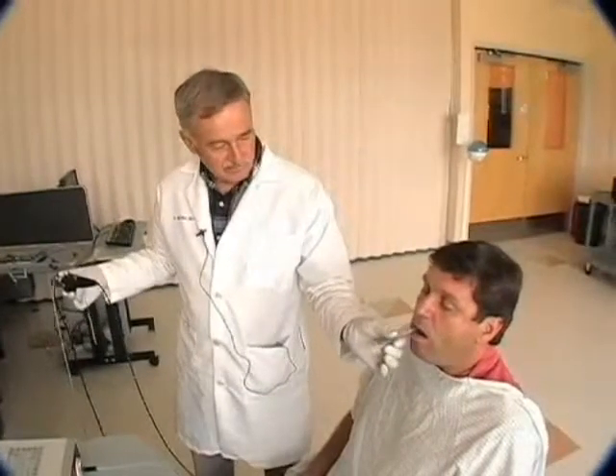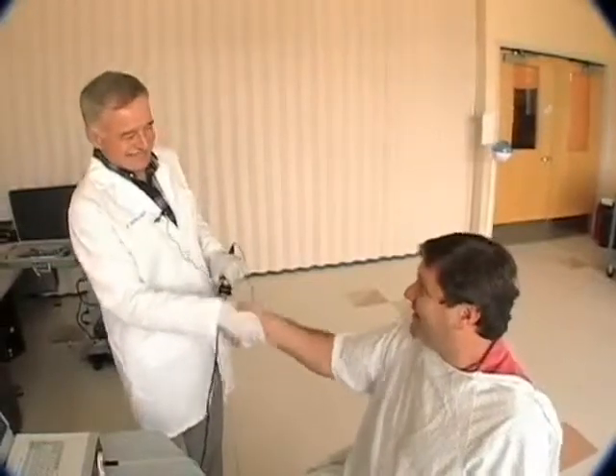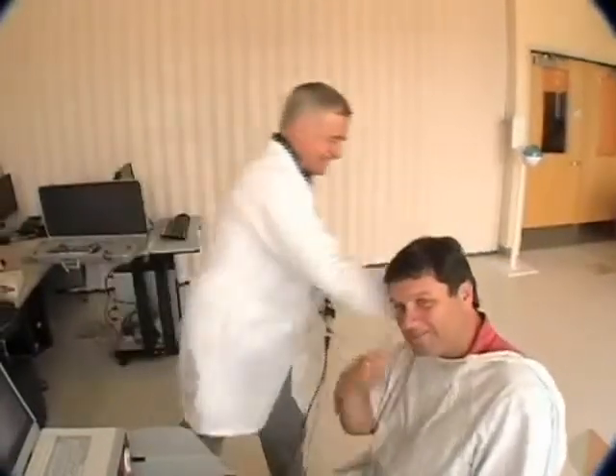Ben, I'm going to remove this right now. Here we go. Congratulations — you're the first patient, the first person's intubation.